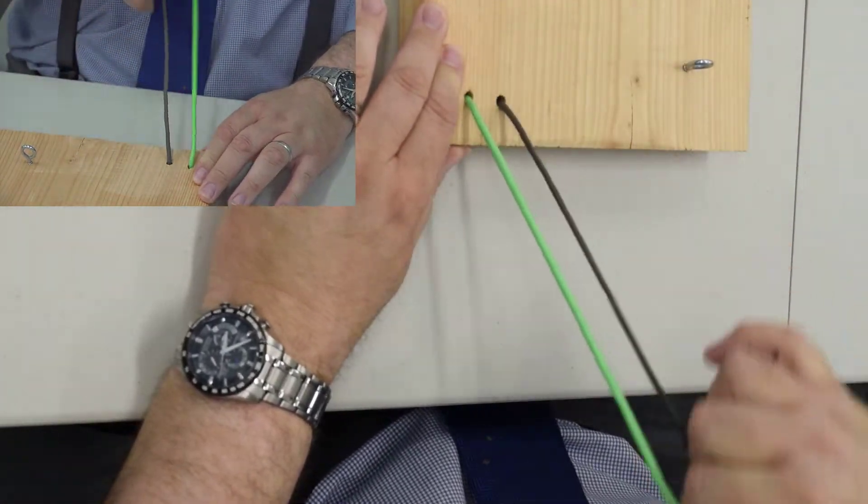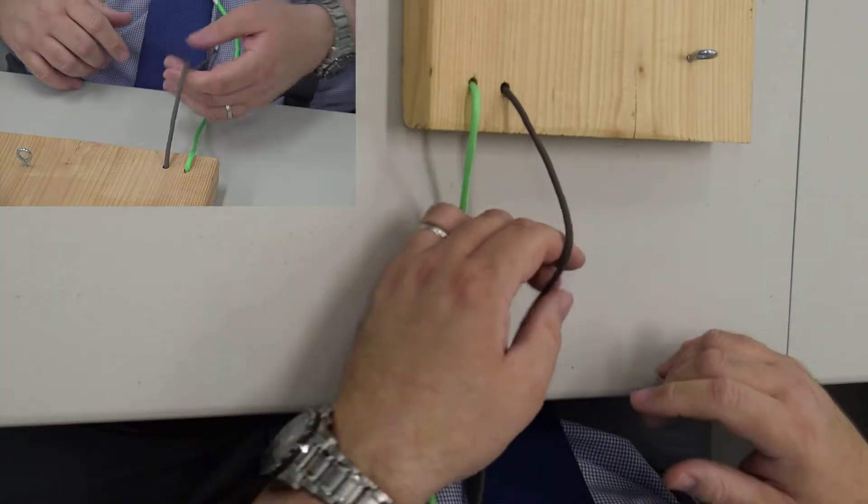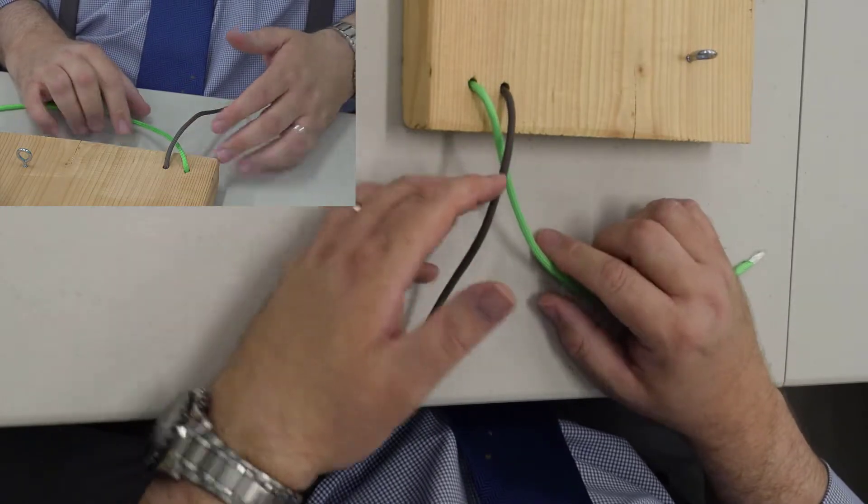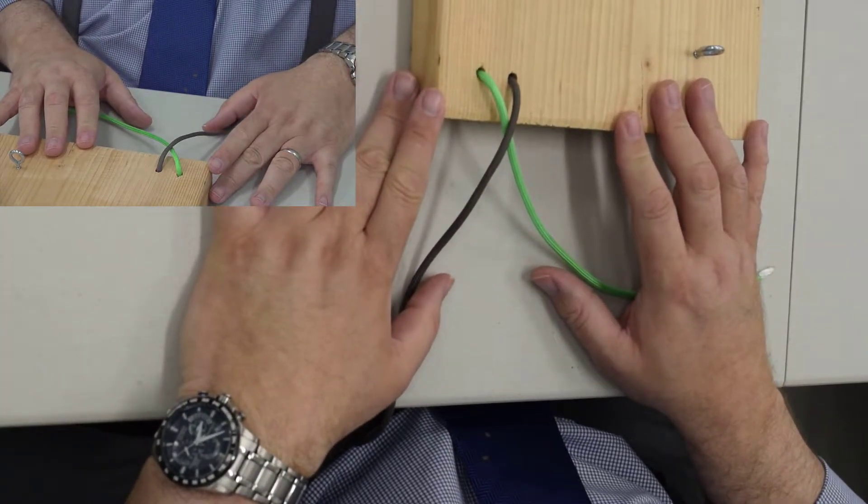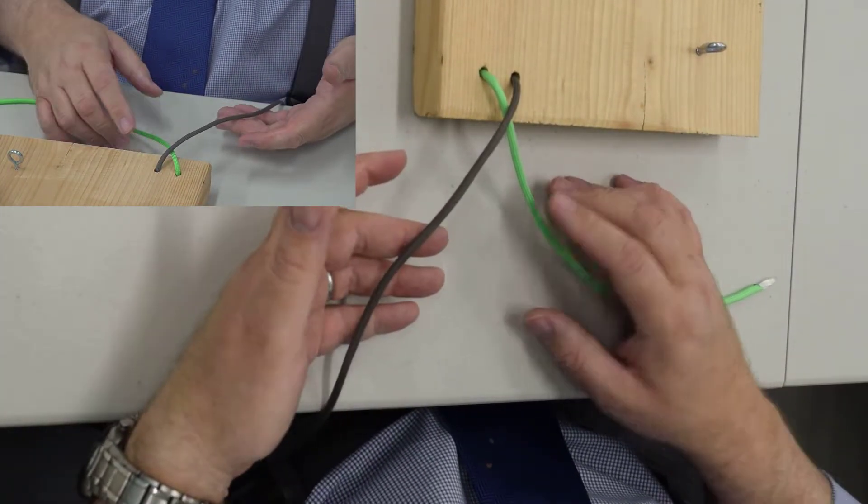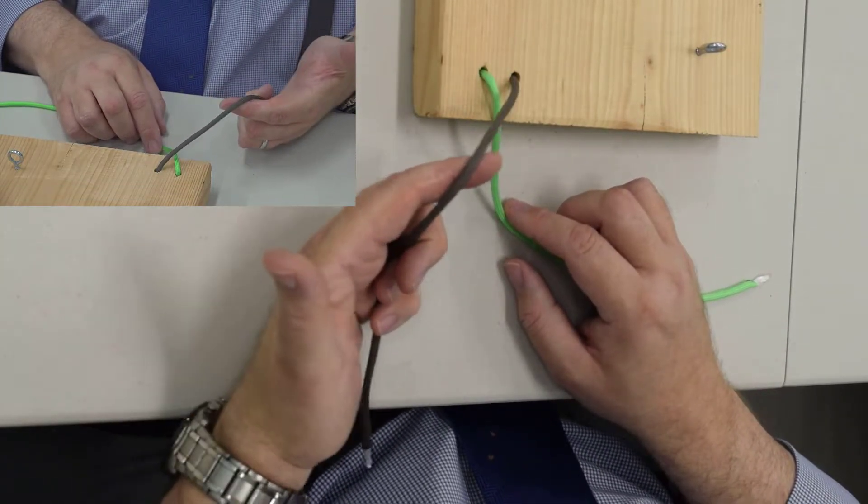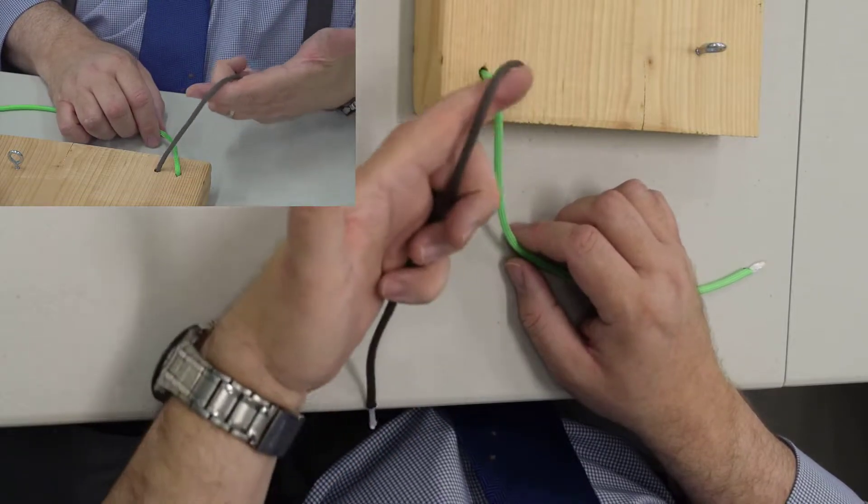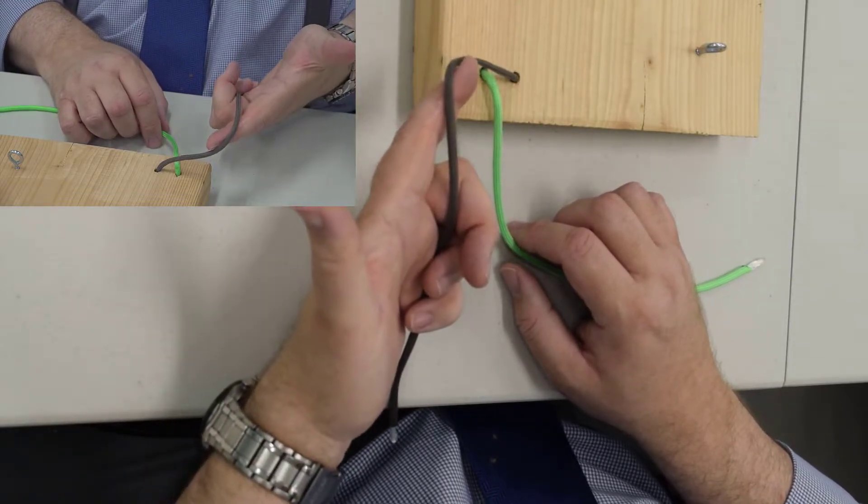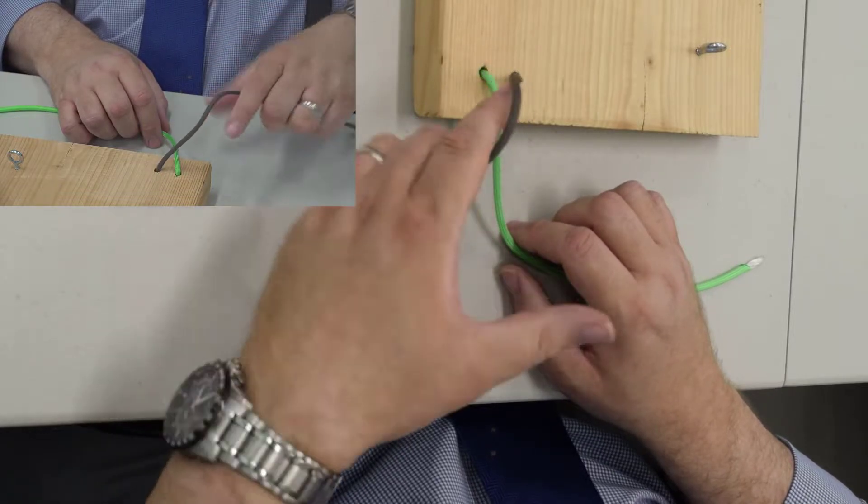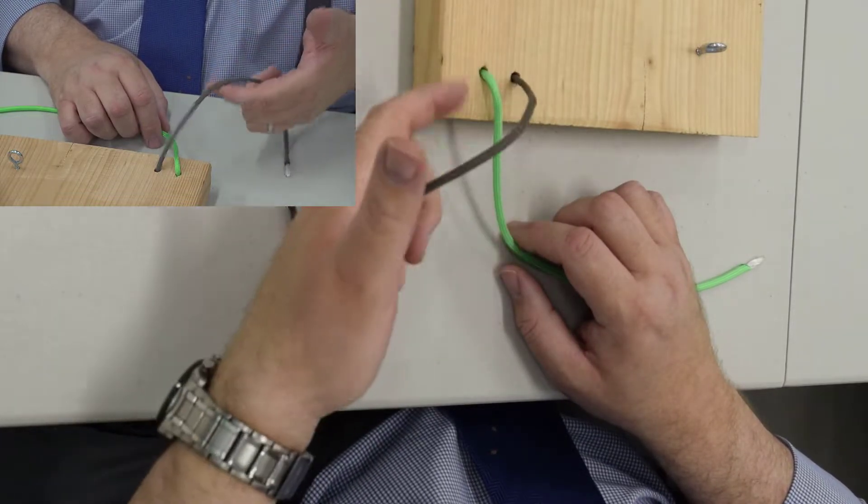So now let me demonstrate to you the two-handed tie. The two-handed tie is similar. So let's start with brown over green. So for a two-handed tie, we do what I call make the gun. And then I say we'll do a flip.